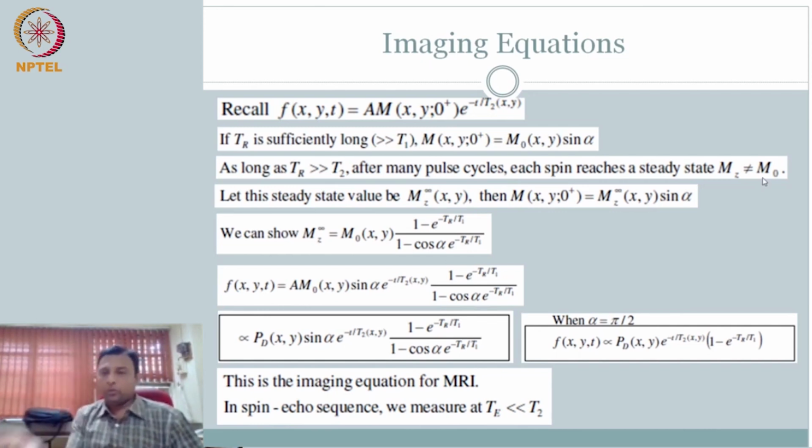The moment you are going to do this pushing experiment several times, repeating the sequence several times, you are pushing this vector every time with displacements. When you do this in dynamics, it has to have some steady state. So when you try to push this several times, you will reach a steady state. That Mz is not equilibrium, but it is a steady state.